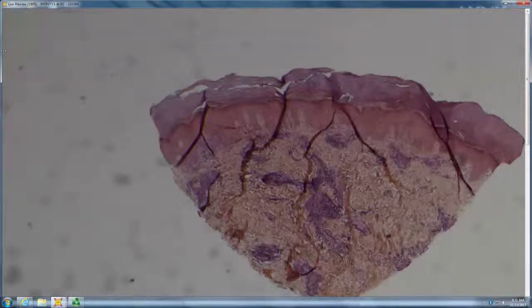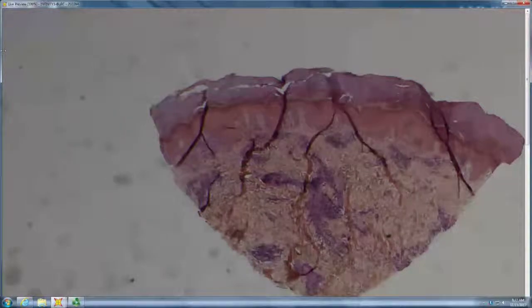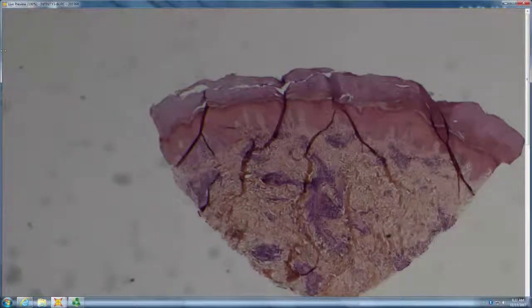Okay. So, Derek, how about this? Looks like we're on the acral surface. Yep. So there's an inflammatory infiltrate in the papillary, reticular dermis, perivascular. And it's all neutrophilic, right? No. So what is it? Lymphocytic. And are they overlapping or are they pretty discrete? Seem to be pretty discrete. Some acral skin, very discrete lymphs, perivascular. Perniosis. Yeah, probably.